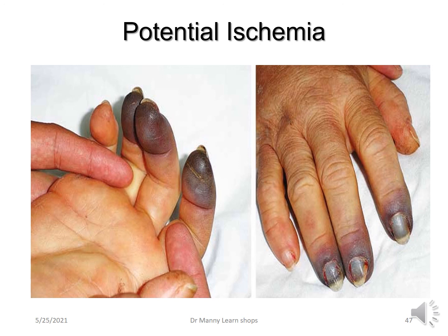Remember, the radial artery is the one that's being cannulated, and it supplies the hand, and it's got a backup in the ulnar artery, which is why you do the Allen's test, to make sure that the ulnar artery is patent before the radial artery is cannulated. If you're cannulating the brachial artery, there's no backup supply. If you now occlude the brachial artery, that's potentially a problem. If you occlude the femoral artery, that's potentially a problem. If you go to the dorsalis pedis, well, you've got the tibial, which can provide backup. So potential ischemia is always something that you would observe for as a nursing consideration.